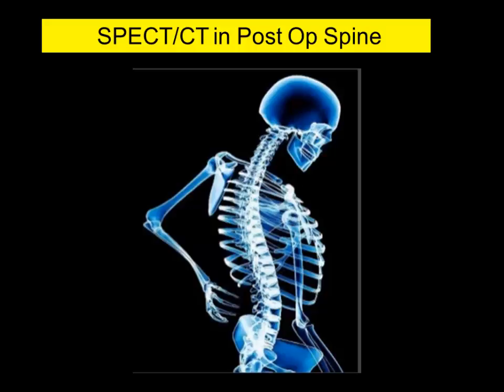I think we had a long, detailed talk by Gopi yesterday about the spines, and he alluded to all the intricacy of the spine anatomy and the normal benign pathology. I'm just going to embark on the post-operative spine, and maybe I've got some slides of benign pathology as well. I've tried to delete it after Gopi's talk, but I'll try.